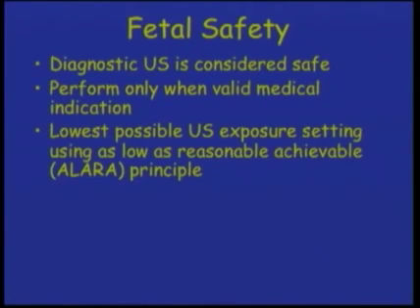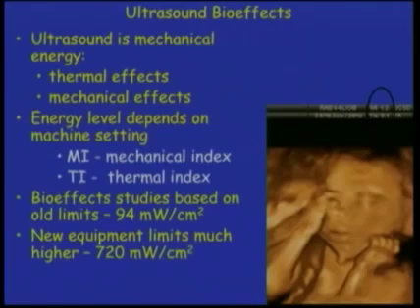Now, for fetal safety, ultrasound is considered to be safe, but we should only perform it when there's a valid medical indication. And that's because we want to use the lowest possible ultrasound exposure settings when we can, the same ALARA principle that we use for radiation, which is as low as reasonably achievable.